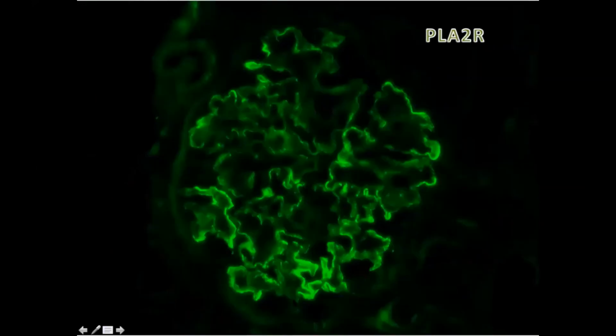So when the PLA2R, okay, and this was the pattern of the PLA2R, a little less intense, maybe an intensity of 2 to 3, but the same pattern, glomerular loops, and then along the glomerular tufts, and granular. All right. Good. And now the PLA2R positivity, it matches the positivity of IgG.